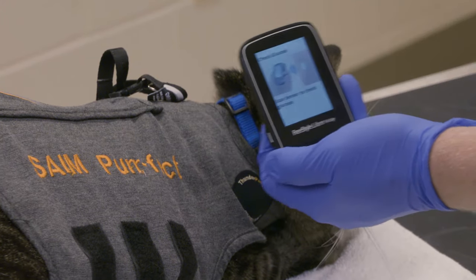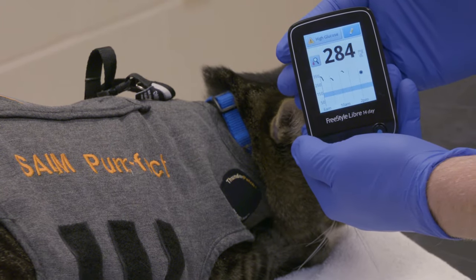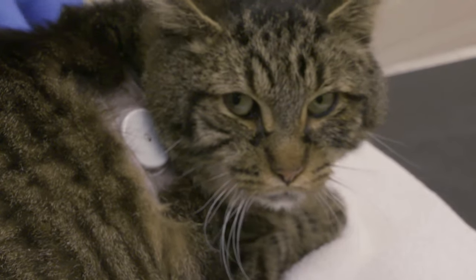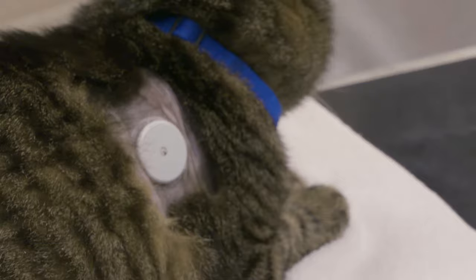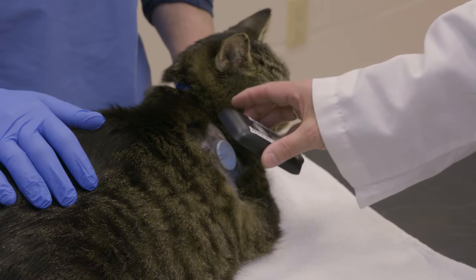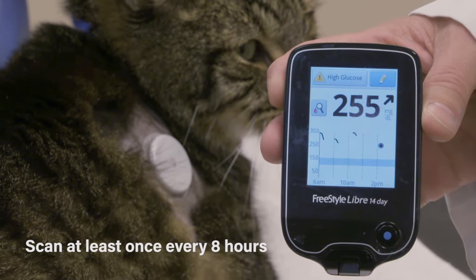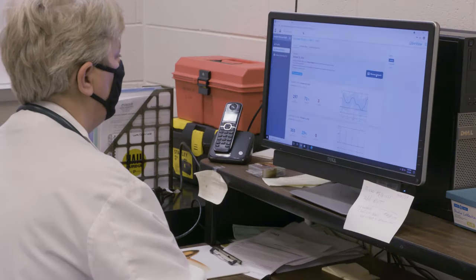The sensor measures the interstitial glucose every minute and stores this data every 15 minutes on the disc. The disc on the patient can store up to 8 hours of data. Every time the sensor is scanned, the data is downloaded onto the reader. The sensor can be scanned at any time, but it needs to be scanned at least once every 8 hours in order to capture all the data.